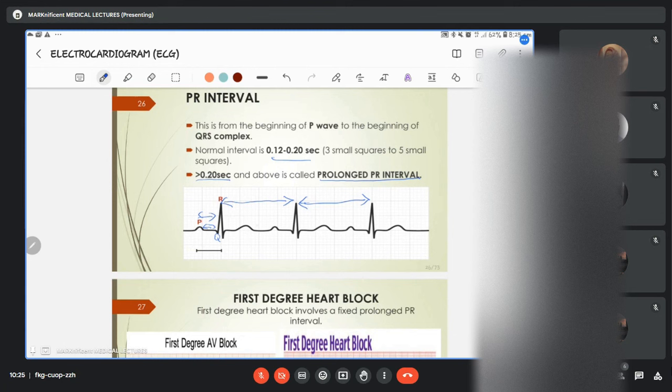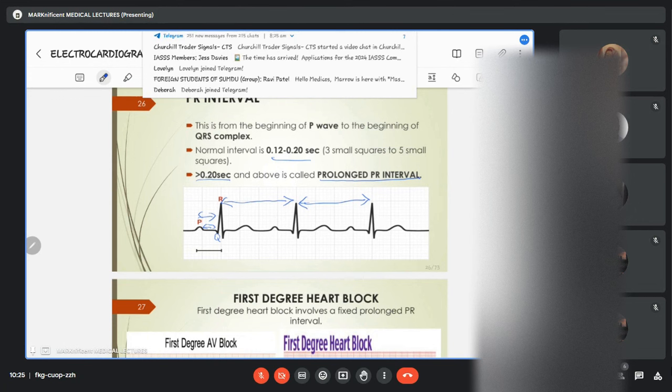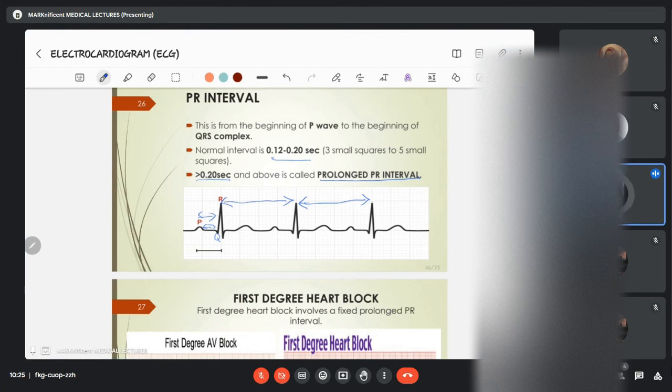It is prolonged. Remember we talked about what? Arrhythmia. It is prolonged already. It means that it is not normal. The reading is not normal. And secondly, it is prolonged. So is it tachycardia or bradycardia? The state of the patient now. Because it is prolonged. It should take more time, slower. Okay, yeah. So it is tachy. No. So Brady. It's Brady. Brady, yeah. Slow.